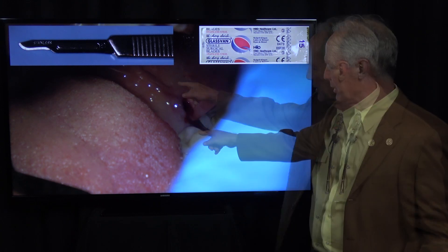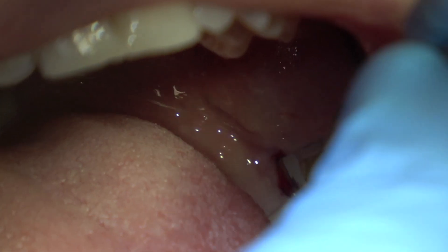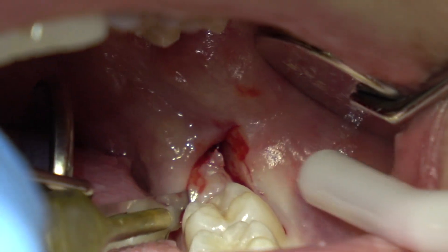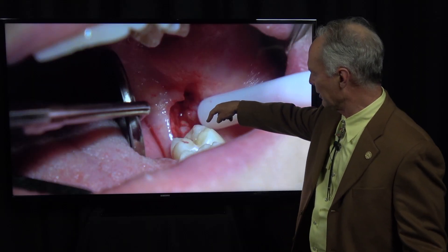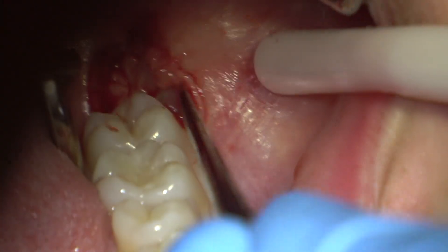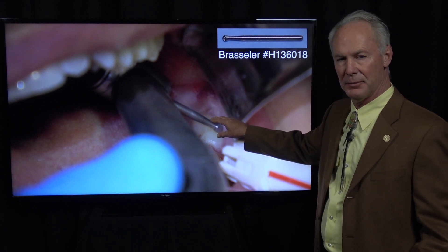These are my initial incisions from the distal buccal aspect of the second molar, back just a little past the extent of the impacted wisdom tooth, using a 15 Bard-Parker blade. Then I'm also incising from that point to the distal lingual of the second molar, and making an incision straight across the distal of the second molar. Then I'm using a periosteal elevator to elevate the periosteum to give me space, creating space into which I can elevate the pieces of this tooth.